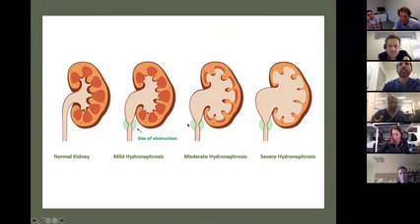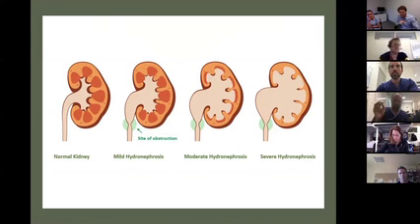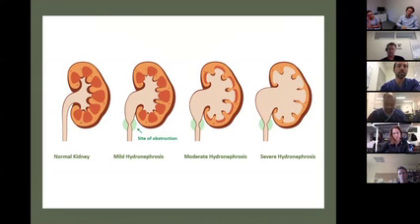So there are a few types of grading systems. One is a 5-stage grading system. The Swiss guys use it, I think Swiss or Canadian, one of them. But the clinically relevant method is mild, moderate, severe. Just stick to this mild, moderate, severe, which seems to be much more reproducible from a clinical perspective rather than the 5-stage grading systems. That's what we've been using, so let's go on to this one.